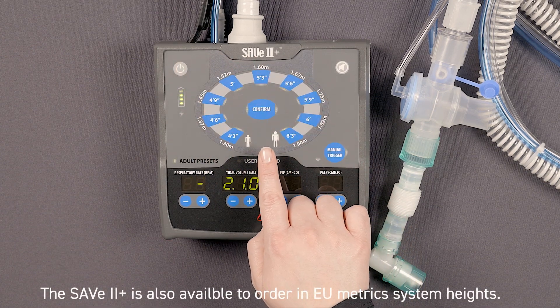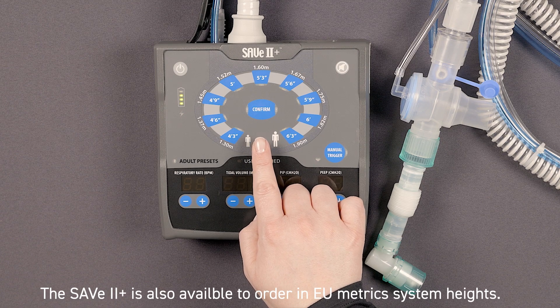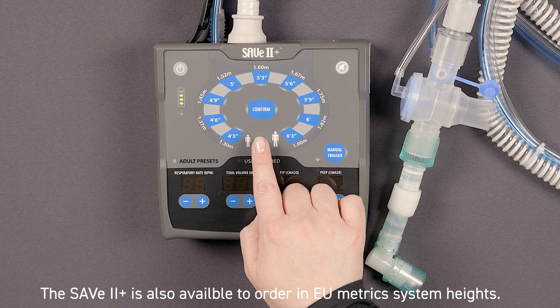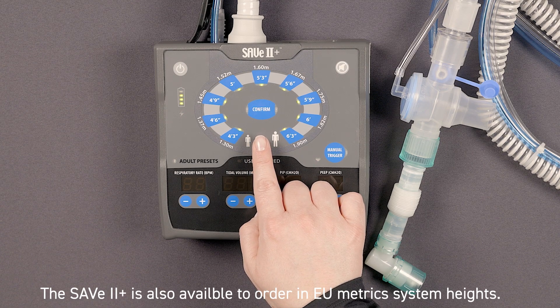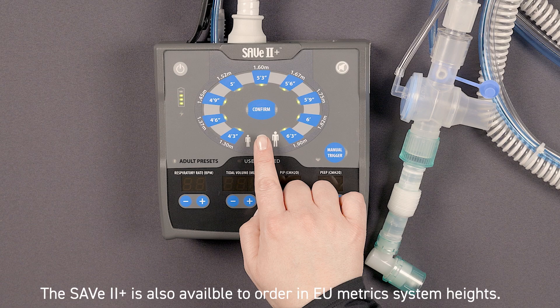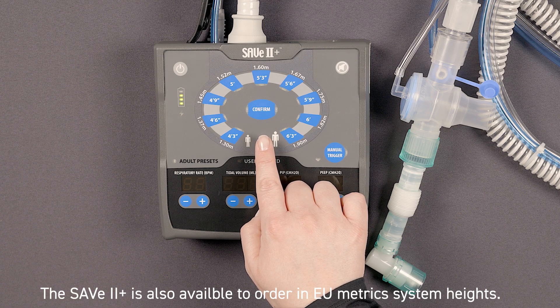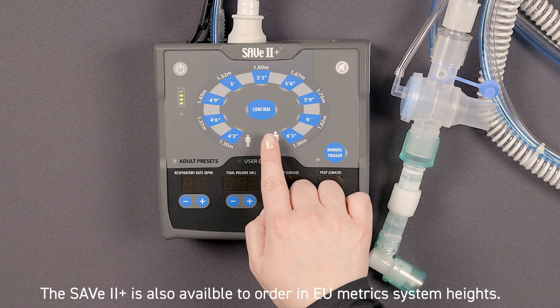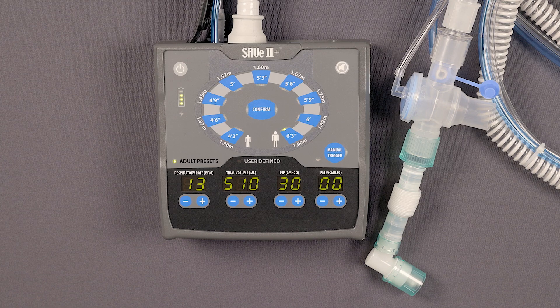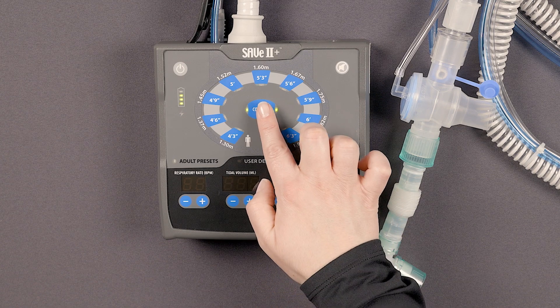These buttons are the adult height presets. When the ventilator is powered on, all the height preset buttons will blink until the patient's height is selected. Once you press the appropriate height button, confirm your selection by hitting the confirm button.